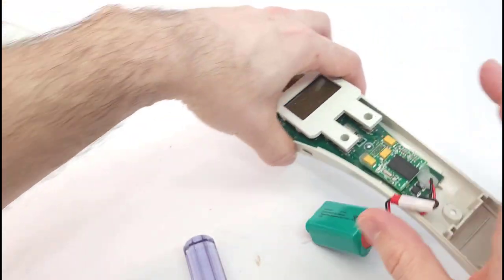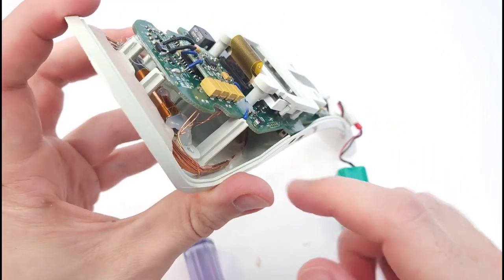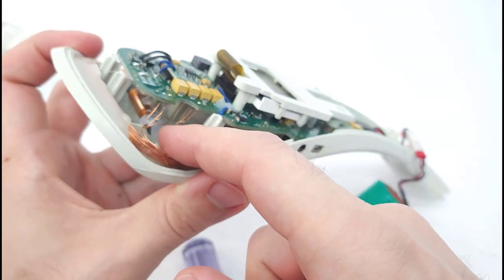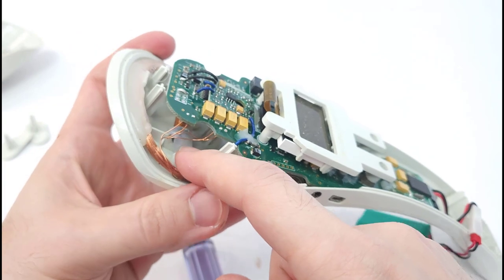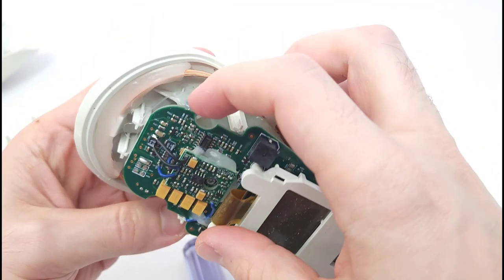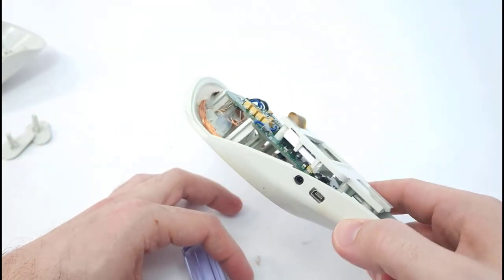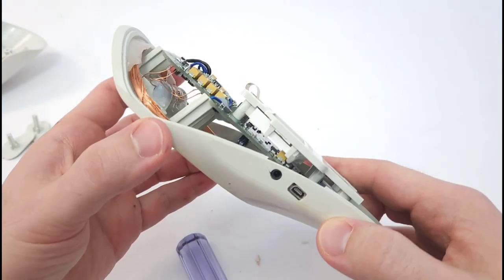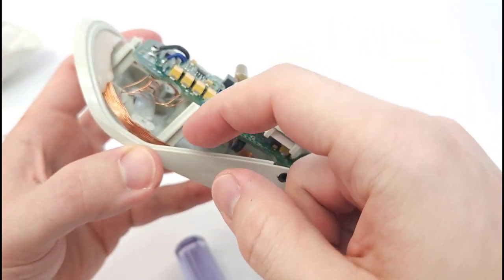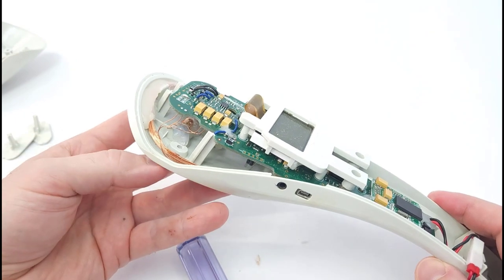What we are interested in is this bottom half, where if we look under the circuit board here, you will see an electromagnet. So there's a metal bar in here with a copper wire wrapped around it, but it is not really screwed into place or held down by brackets or anything. It is just held down by a blob of hot glue at each end that attaches it to the case. And again, over time, with putting this thing down, picking it up, moving it around, eventually that glue comes loose, that magnet will just kind of still be attached to the wires, but wobble around in the middle of the case, and the scanning won't work properly.